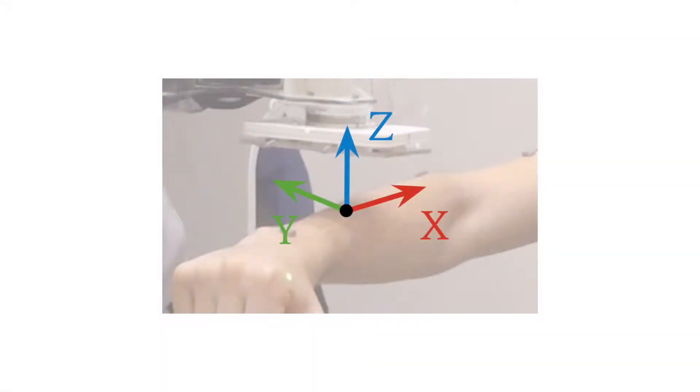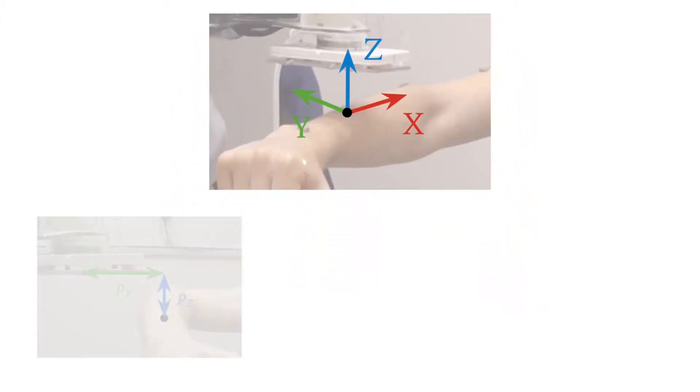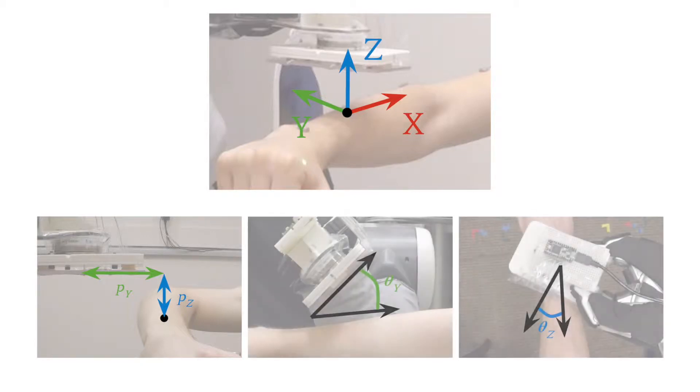This capacitive sensor design enables a robot to sense both the position and orientation of a person's limb. We consider the relative vertical and lateral position to the closest point on a person's limb, as well as the pitch and yaw orientation between a robot's end effector and the central axis of the limb.